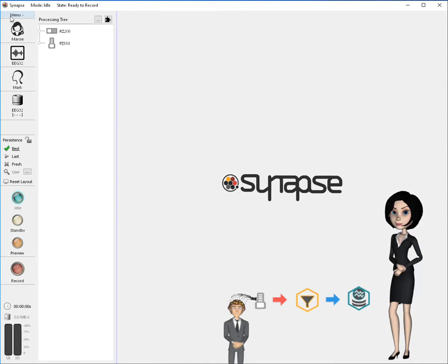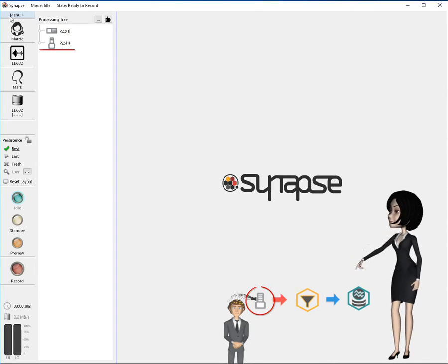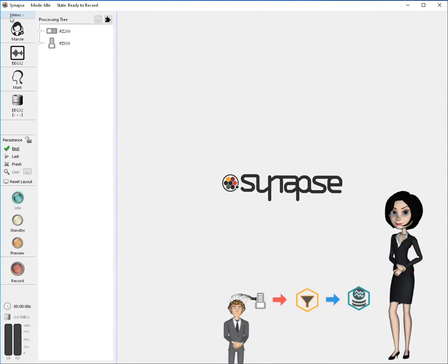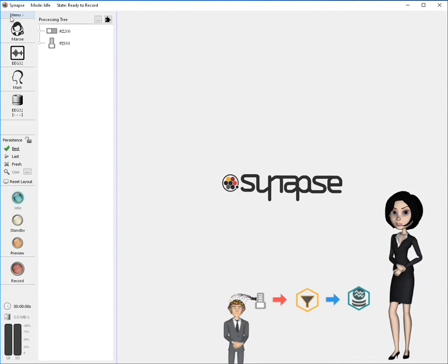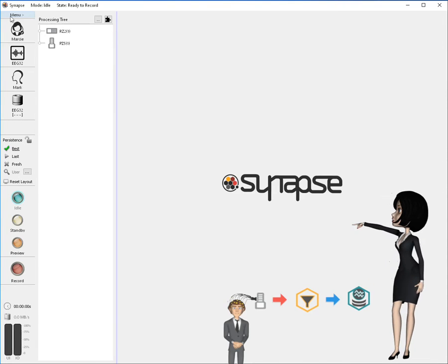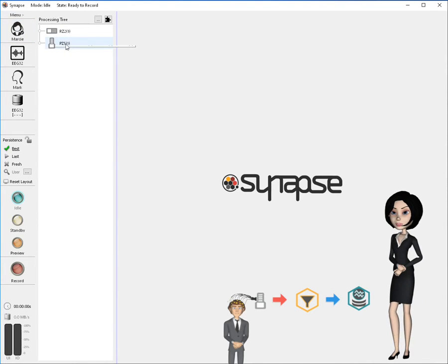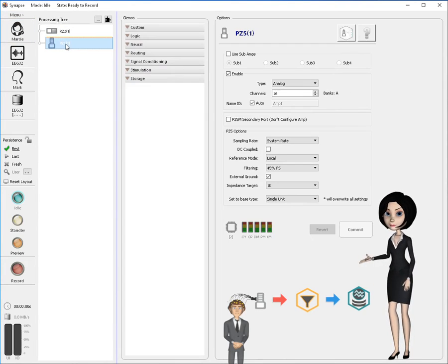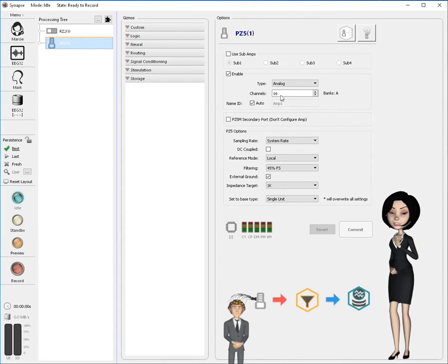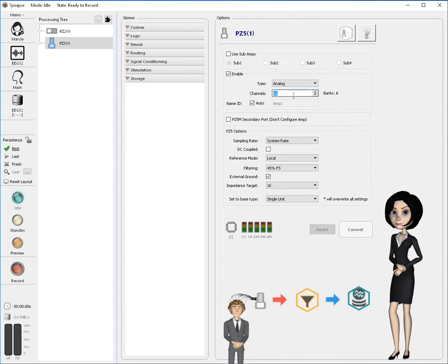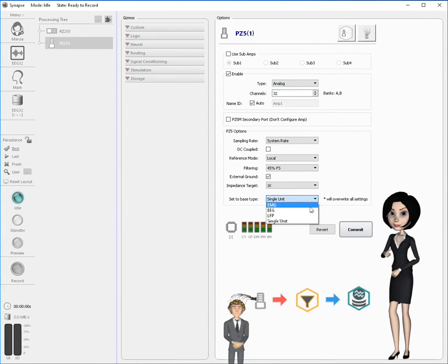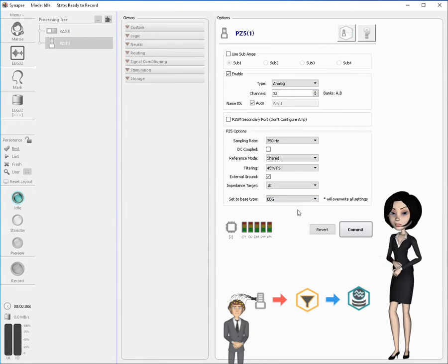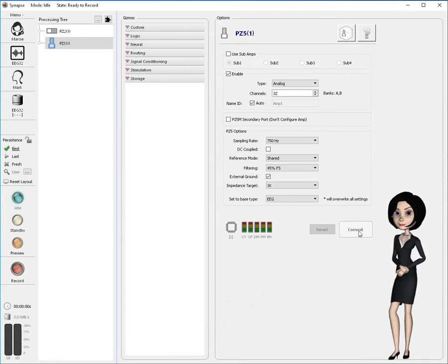As we think about building our experiment, we think first about the signal source, the PZ5 amplifier. It will collect the very small signals from Mark's brain and amplify them for processing and storage by Synapse. Click on the PZ5 in the processing tree and its options dialog will appear. Now I'll set it up for operation with the proper number of channels using settings appropriate for EEG recording. When all is as you wish, click commit to save these settings to your experiment.